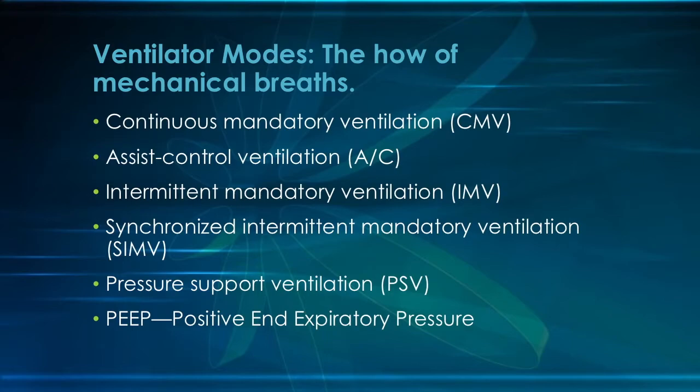The last two are actually not ventilator modes, but they're kind of ventilator support. First we have pressure support. Pressure support lets the patient breathe on their own, and the machine is going to apply extra pressure. So we have to assess and look at the needs to adjust the rate and the tidal volumes based on how much pressure they're getting. Remember, with anything with pressure support, we could have problems like barotrauma. So you don't want to overdo the pressure.